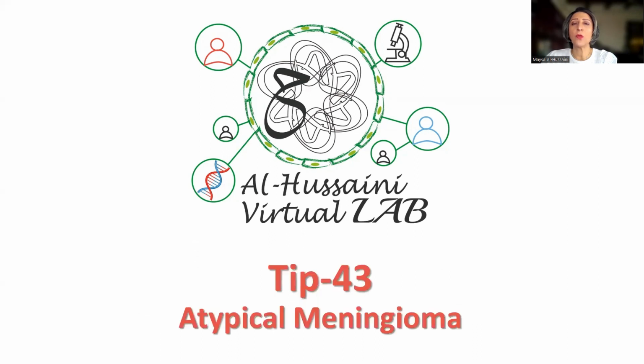Today, I'm going to share with you an interesting case of atypical meningioma and how we can use Ki-67 in particular to locate mitosis and start our counting.